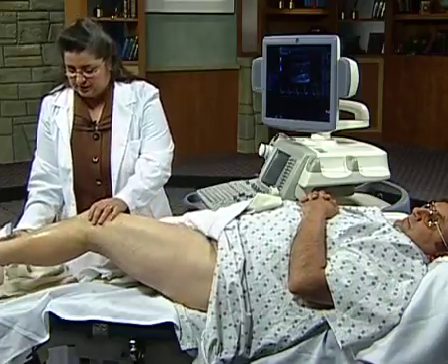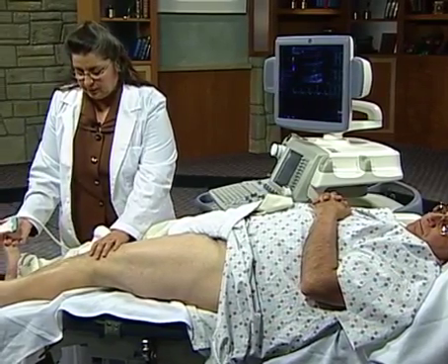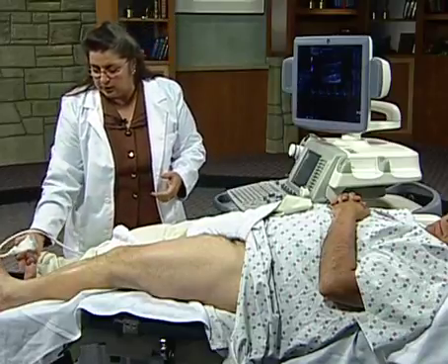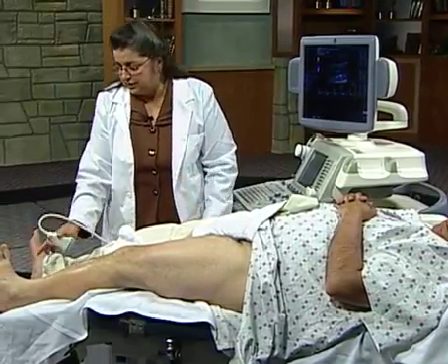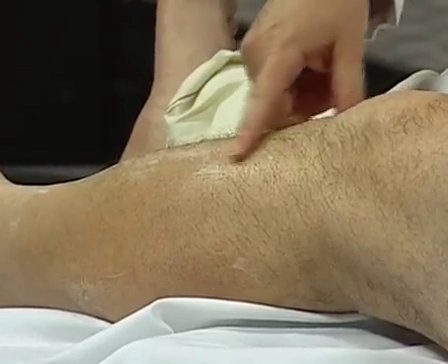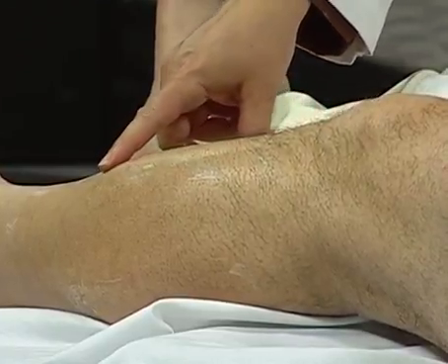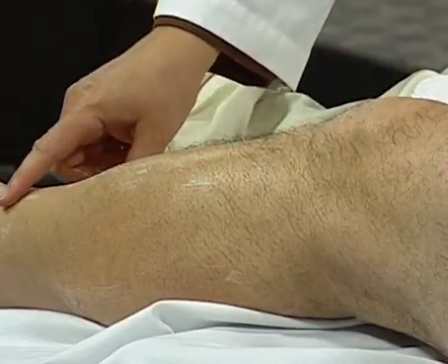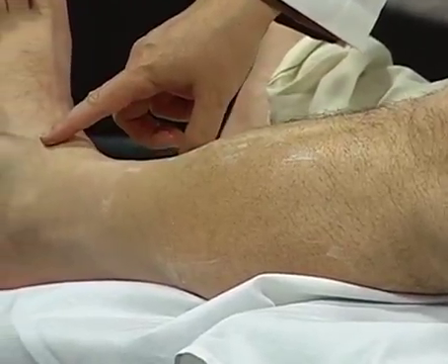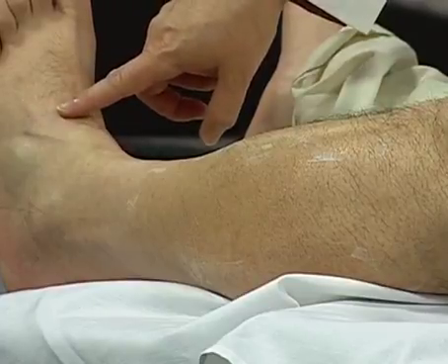Okay, now we're going to bring the patient's leg back down, the last vessel we have to look at, and we'll have them sort of roll their knee a little bit here. The last artery, we looked at the peroneal artery, we looked at the posterior tib, we're going to look at the anterior tibial artery. The anterior tibial artery actually courses through the interosseous membrane somewhere in this level and then comes along the outer edge of the tibia, coming down the calf, all the way down, slowly continuing down and coming across the ankle somewhere in this region, and it forms the dorsalis pedis artery.